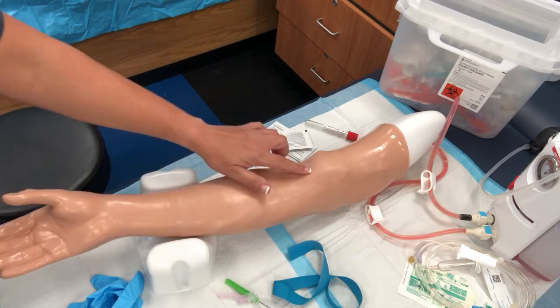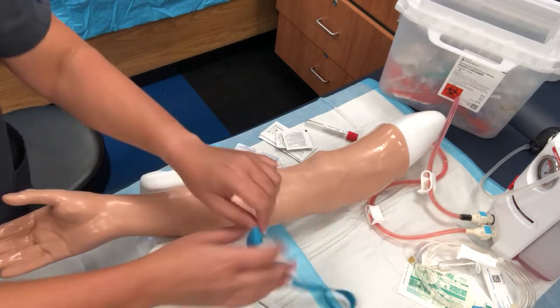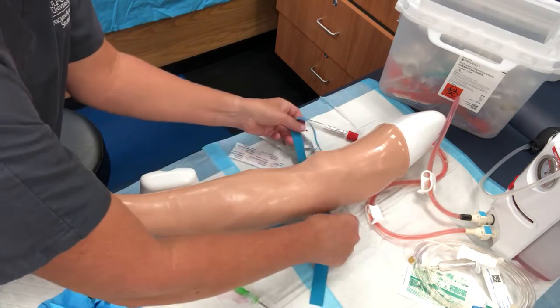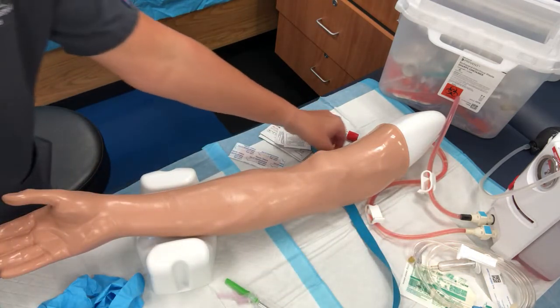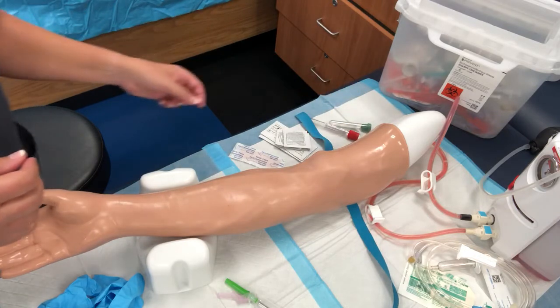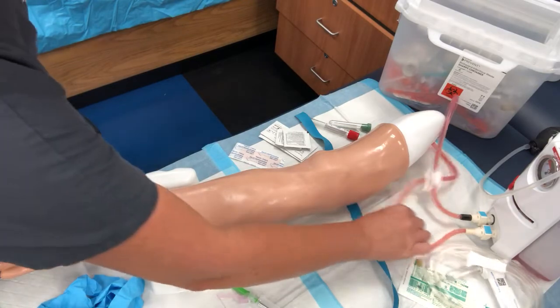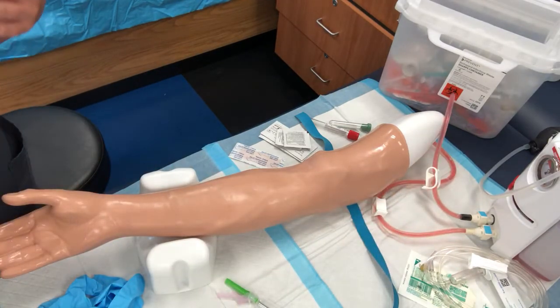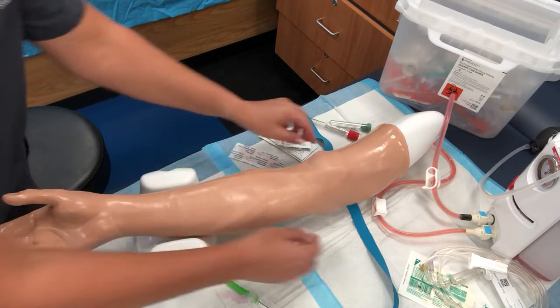Now once we have that vein situated exactly where we want it to be, most people will go ahead and place a tourniquet on their patient. And for those of you who've never even put a tourniquet on before, let's talk through that for just a moment. You don't need to tie a knot. We're not wrapping a present, okay? We need to ensure that we could quickly get the tourniquet off, and we only have one hand because we're still going to be using the vacutainer to obtain that blood supply.